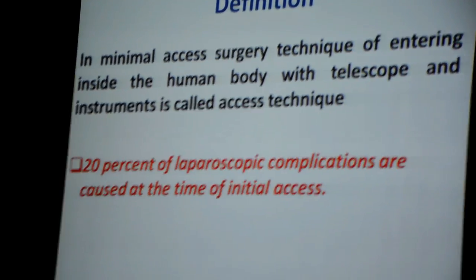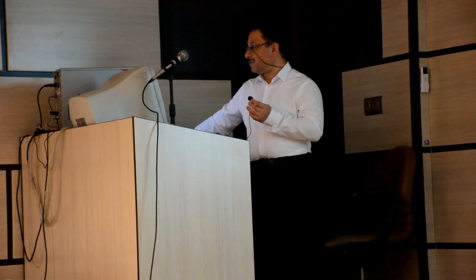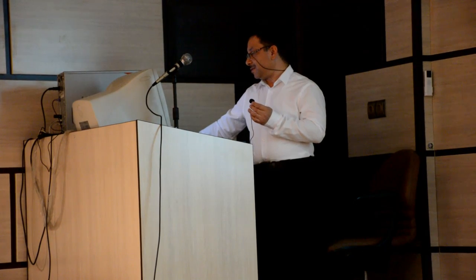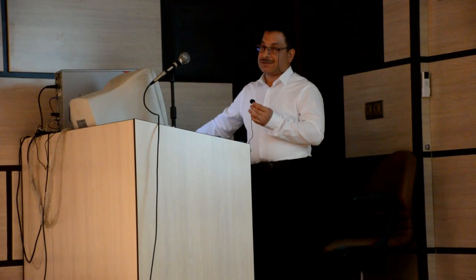I'm sure that all of you know these simple principles about how to access the abdomen during laparoscopic surgery. The minimally invasive surgery technique of entering the human body with a telescope and instruments is called the access technique. And 20% of laparoscopy complications are caused at the time of initial access. It's very important to be careful in entering that domain.